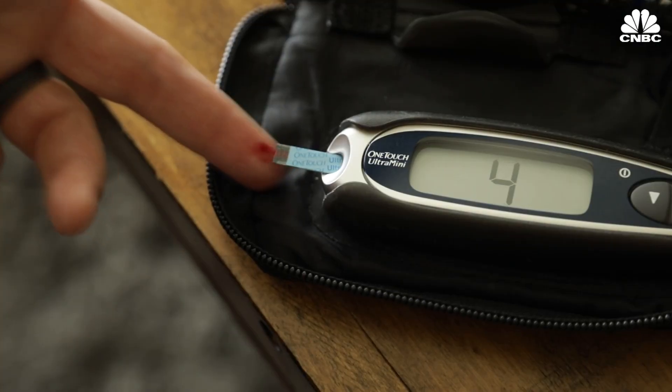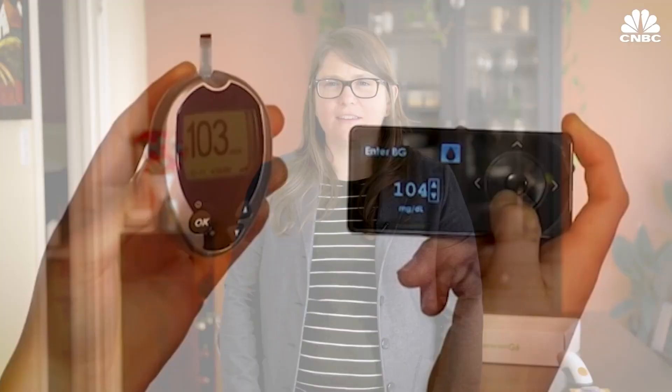Previously, CGMs needed blood in order to work. This newest sensor from Dexcom is FDA approved to require no blood at all. And after 20 years of having to prick my finger so many times, I wanted to see how accurate it was.